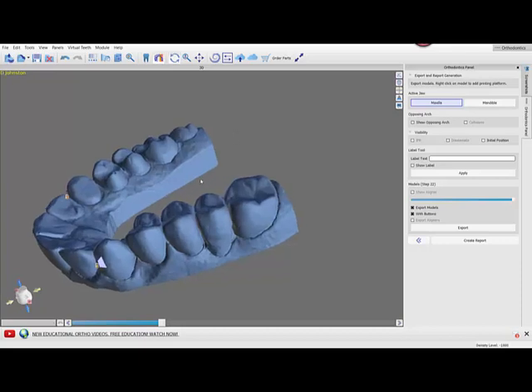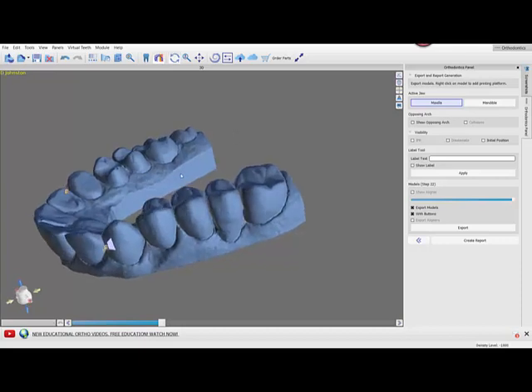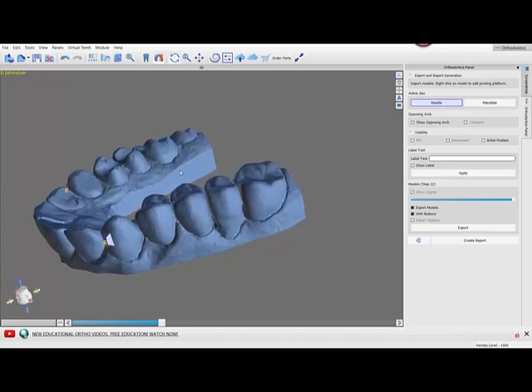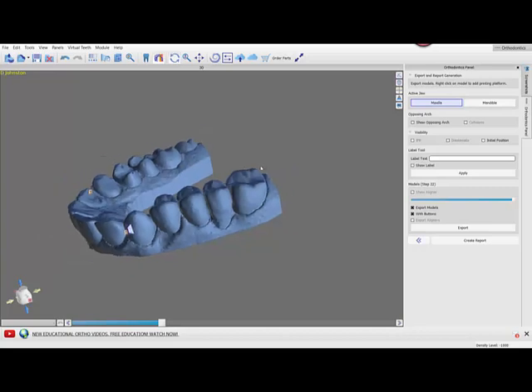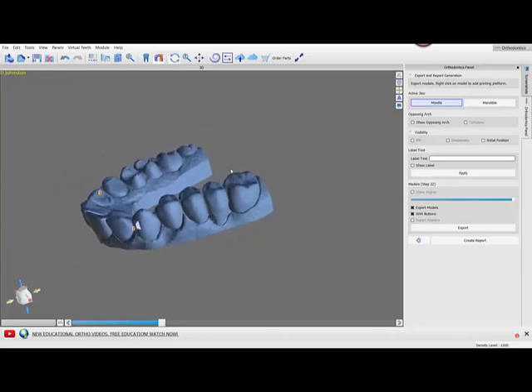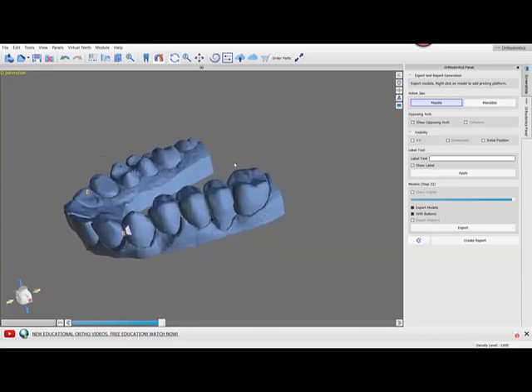Hey everyone, it's Baron. I just wanted to make a quick video talking about adding a platform in the Blue Sky Plan orthodontics software.